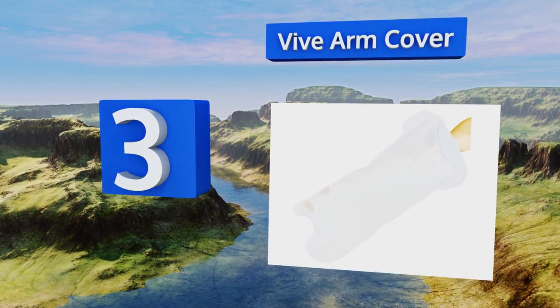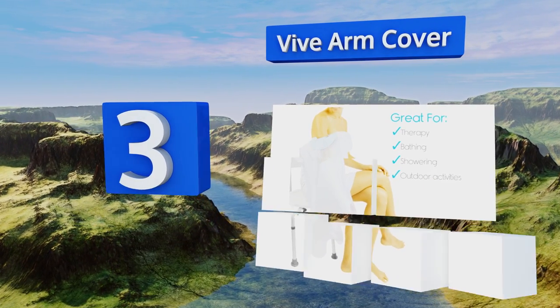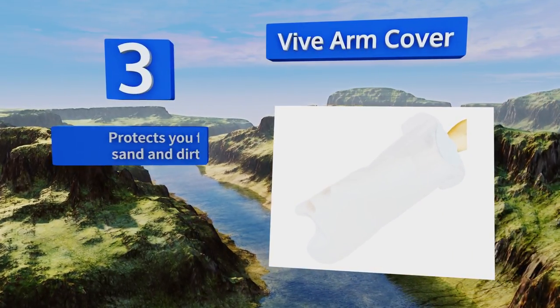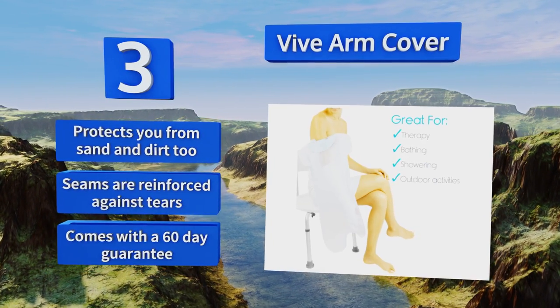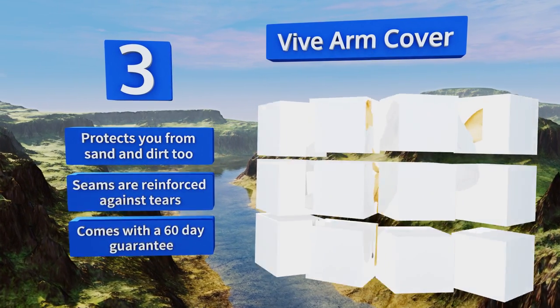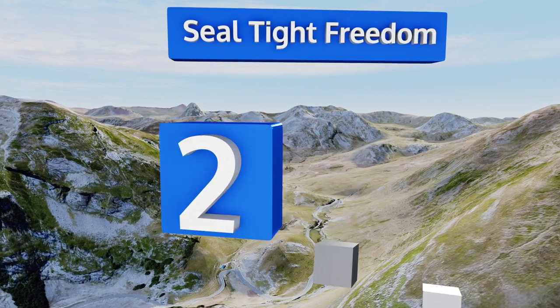Nearing the top of our list at number three, the Vive Arm Cover has special pull tabs that allow the user to secure it to their arm. Waterproofing a limb isn't easy given how many different sizes and lengths they can come in — this tab won't fix it for everyone, but it should help you get a little more leeway. It also protects you from sand and dirt, the seams are reinforced against tears, and it comes with a 60-day guarantee.